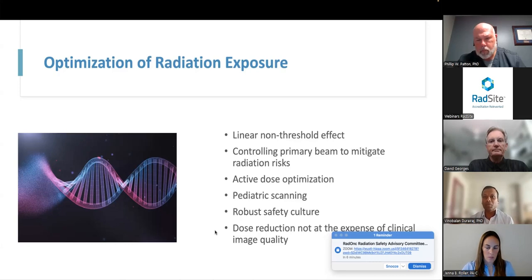So is there anything else that you have, Dr. Patton, Dr. David, and Jenna, as closing comments? Oh, nothing to really add to this, other than I'm very excited about the CBCT technology. I think that as we've discussed, it's usually a smaller piece of equipment, so it's easier to get into facilities. The radiation exposure is less. Once all the physics of cone beam technology was worked out, the image quality is where it needs to be. And I think it brings this type of scanning to a greater population.